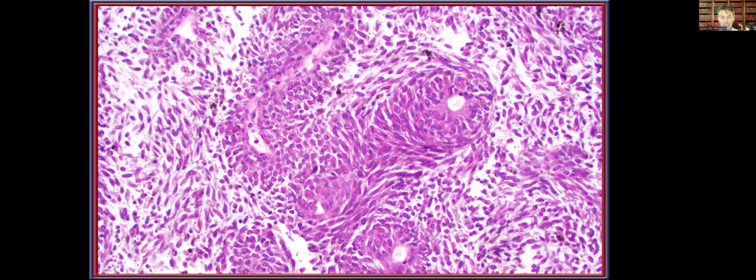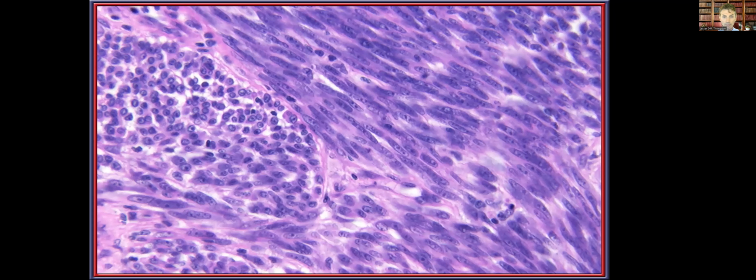An example like this, where there is a peritheliomatous distribution, again, wrapping around the vessels, but here you can see pigmentation is present in some of the neoplastic cells, and so that would be a tip-off to the underlying diagnosis. When you see an area like this with these elongated nuclei and scant cytoplasm almost presenting as a syncytial architecture, the notion of a melanoma may be quite difficult to reach. However, you will notice that there are actually quite prominent nucleoli.